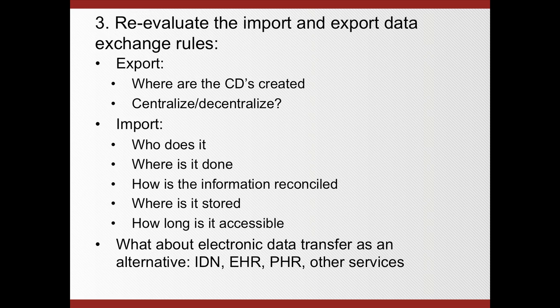Also rethink where you want those images to be stored. Do you want them stored only on the short-term archive? Do you want them automatically removed? So how long is it accessible? And take into consideration also the business model of your new system. If you have to pay for each image that is being stored, and a patient comes for a follow-up CT and brings with him like 20 disks with prior CTs, and you also have to pay for storing those 20 prior CDs, you need to be aware of that. Take that into account, so that for that particular patient there will be a higher cost involved.